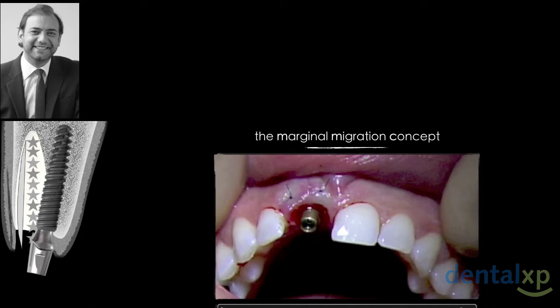We do not suture conventionally over the margin and the papillas, because if we suture conventionally, we tend to push everything in and up. So we will suture this way. As you see in the sketch here, we go deep in the palate in order to have two very stable sutures and enter almost at the same position buccally.